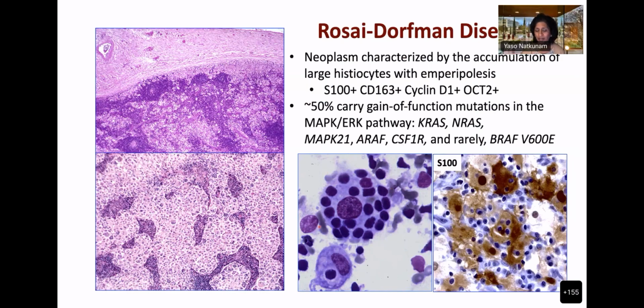So here is a question for you. This appearance, is it pathognomonic for this disease? If you see this cell or cells, is it Rosai-Dorfman disease? Not pathognomonic, right. There can be other conditions also. It can be a non-specific finding in lymph nodes, just like hemophagocytosis can be.